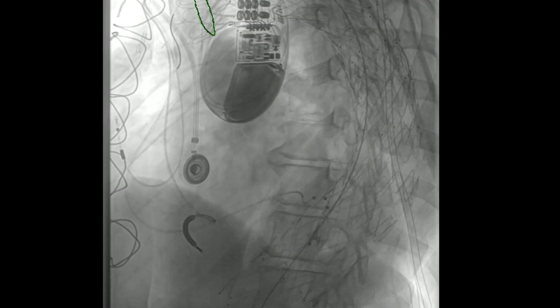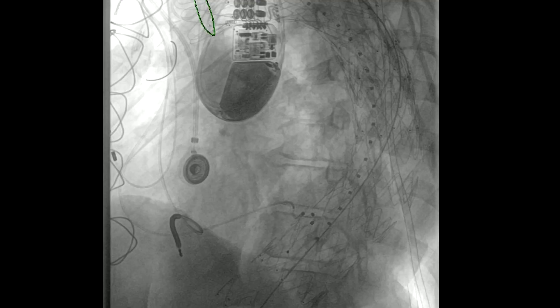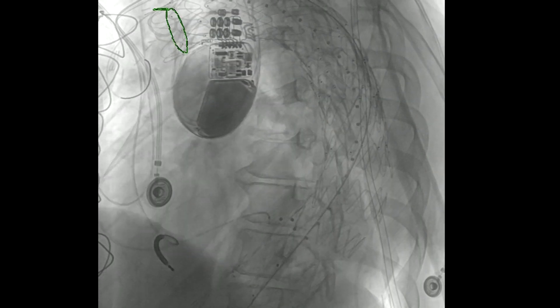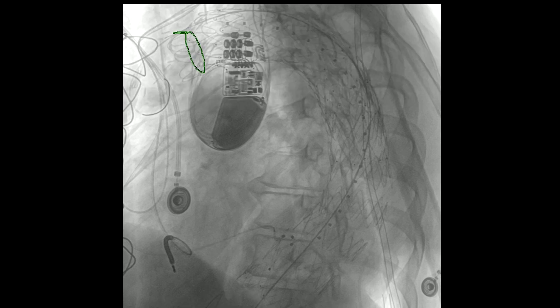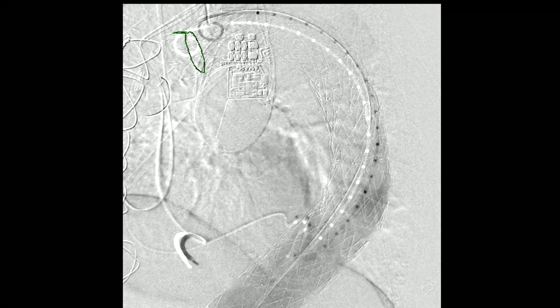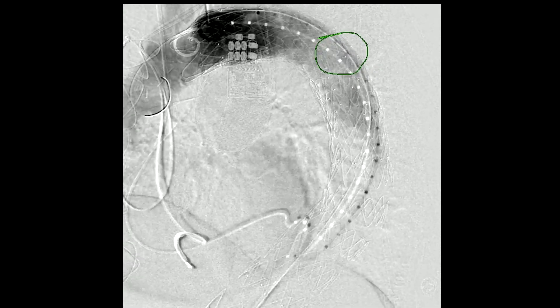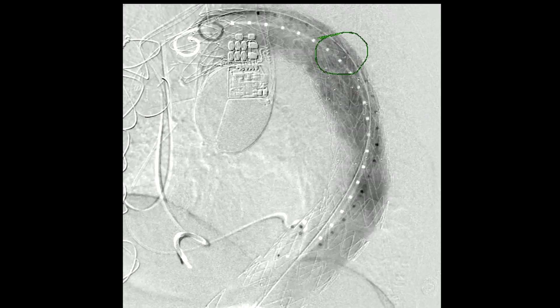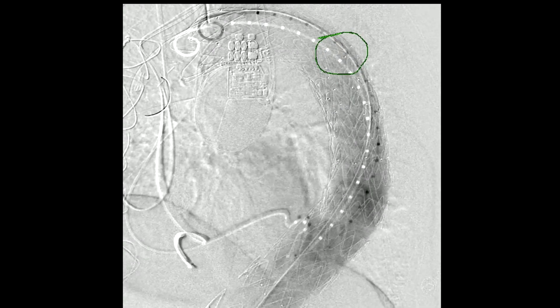Proglides have been inserted in both groins preoperatively. The pigtail has been repositioned after being freed from being trapped between the proximal endografts — you generally straighten it over the wire, pull it below the last deployed endograft, then re-advance. These videos have been accelerated by about 300%, three times baseline. Now there's no evidence of an endoleak. In general with long-segment coverage like any thoracic endograft, we like to wake the patient up in the operating room and have them move their legs — that's the one opportunity you have to go back in and change something.